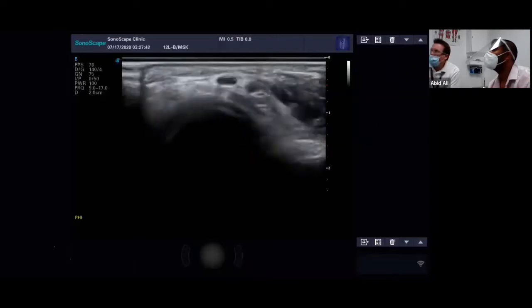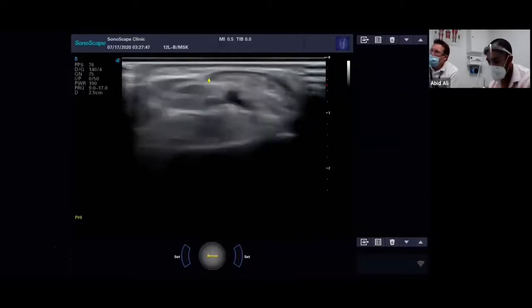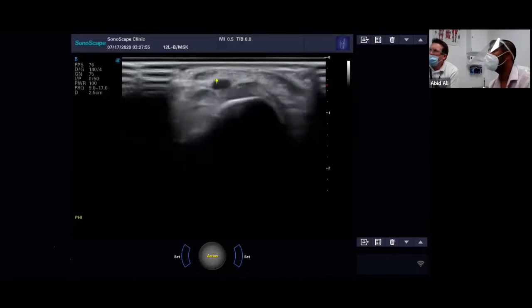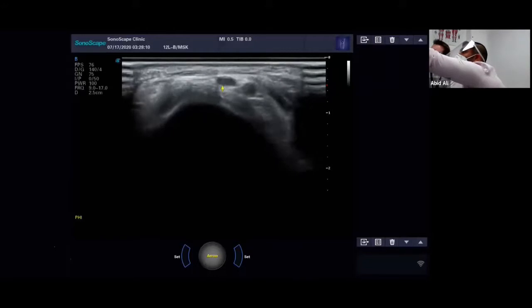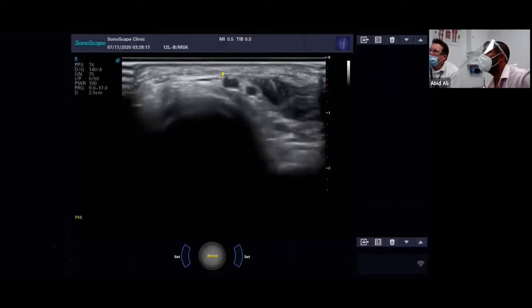A bit more depth. So you see, as the layers change, we've gone from a fairly deep layer, we're getting more and more superficial, so you need to adjust. So there'll be like little pancakes. 1, 2, 3. There you go. You can see the arteries are thinned out as well. Yeah. And you can just about make out the thin slips. Can you just point those out for people? Thin slips. Just there. Oh, here, yeah. So that's the extensor digitorum breaking up.